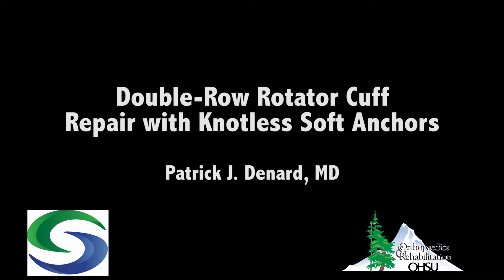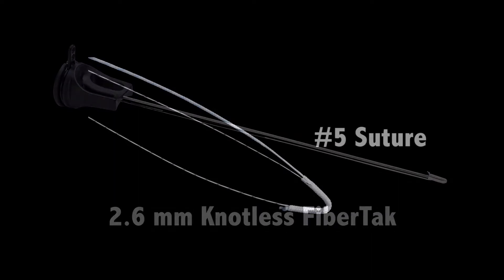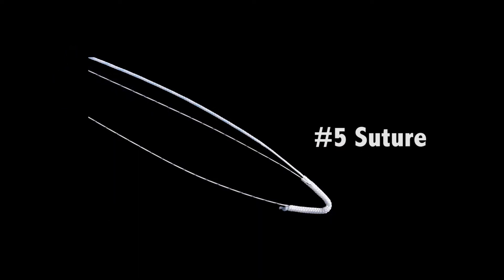This video demonstrates case examples of double row rotator cuff repair using knotless soft anchors. I use a 2.6 millimeter knotless fiber tack anchor for the medial row, then take those suture limbs out to a swivel lock anchor laterally for a knotless repair. What's unique about this knotless soft tissue anchor is that there's a number five suture and a knotless mechanism in the sheath, as seen in this close-up view.